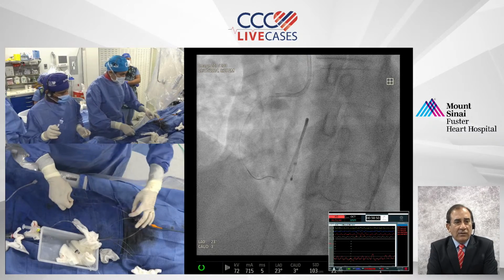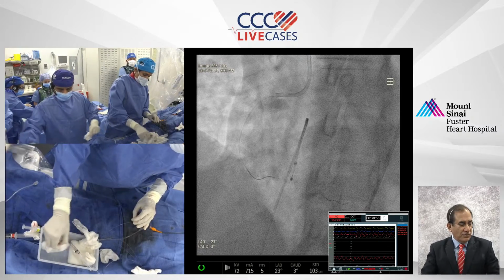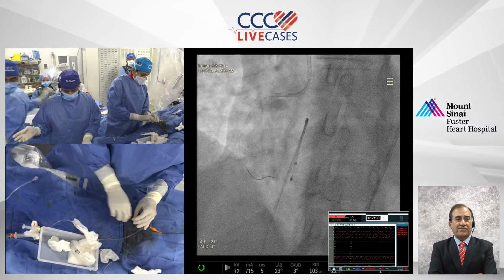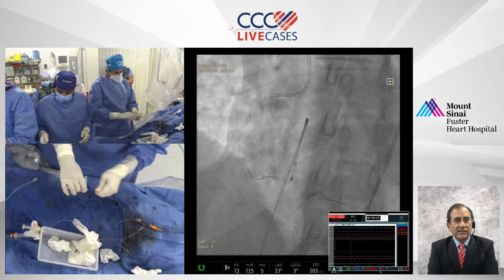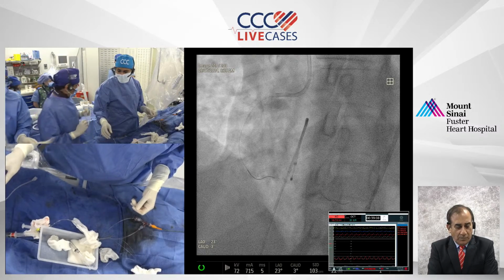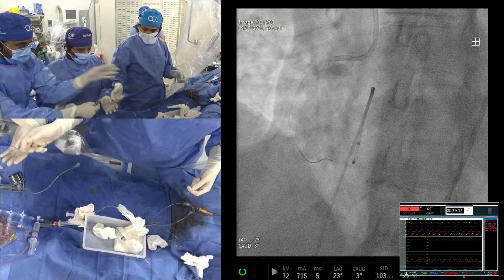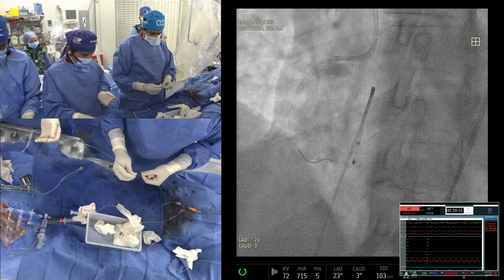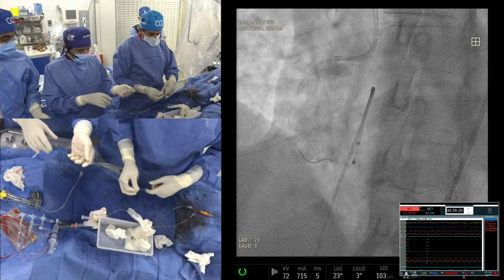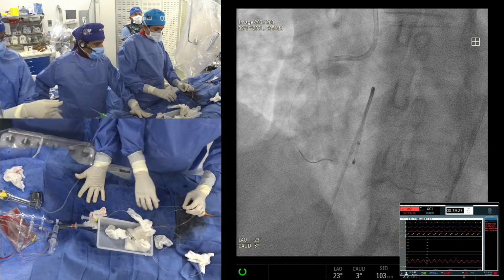Now that OCT is becoming so sophisticated in demonstrating, I've become more and more biased towards OCT as a far better comprehensive evaluation of calcification than IVUS. The question is quantification, maybe a little interpretation. Mainly the depth. I think the depth is totally lost with the IVUS. Yes, clearly that is true because there is no shadow after.